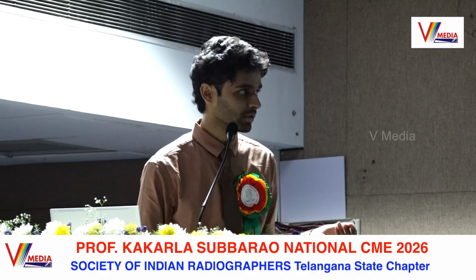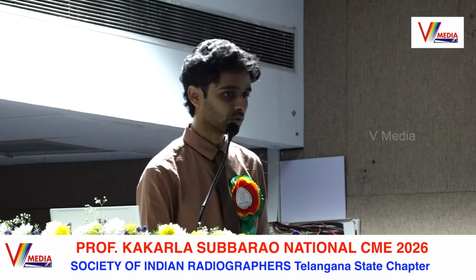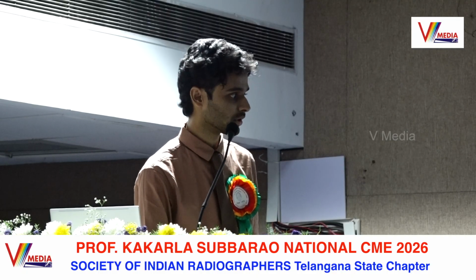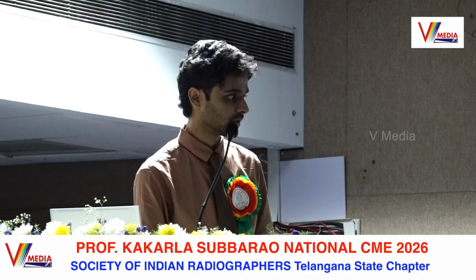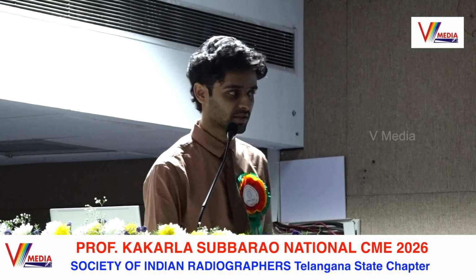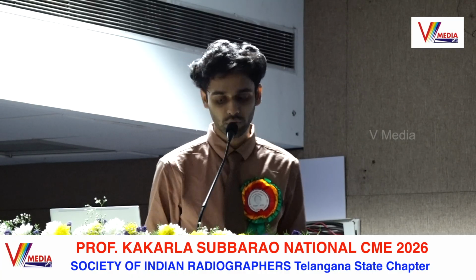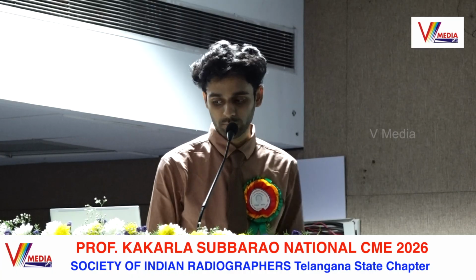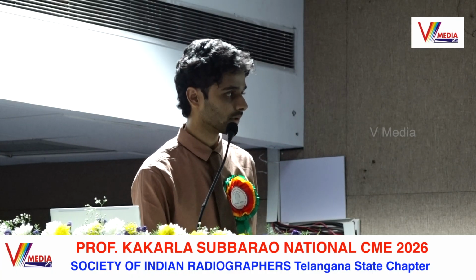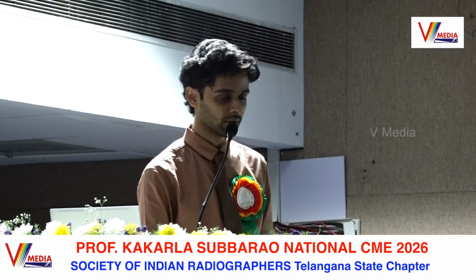And there is another small clinical application, MR fusion for evaluation of anal fistula. So in a regular anal fistula, some fistulas might be difficult to address. So here we have an axial T2 weighted image with a DW image. When we have fused them together, you will have an image that has good anatomical details, and if you have color grading, it will be more informative. So we have some parameters that we need, like I previously told. We need to adjust a proper window level and the threshold level, like I have previously told.